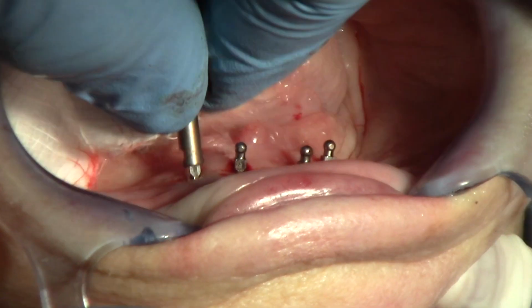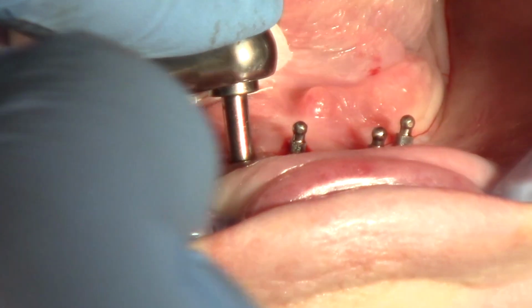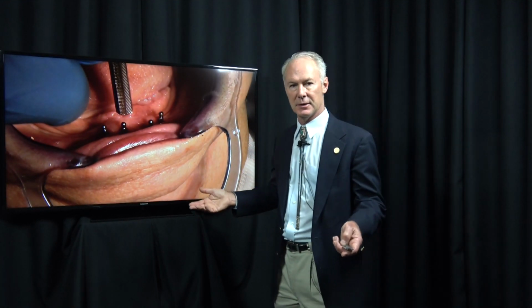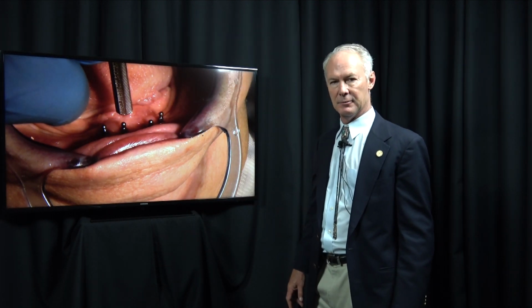So if you can get 4 on the mandible, that's ideal. You can see these are nice and parallel. If you can get 4 implants in the mandible and ideally 6 in the maxilla, that's wonderful. Now, sometimes, especially in the maxilla, you have a hard time finding good bone. And I've had very successful cases where you only had 2 in the maxilla. But ideally, you'd like 6 in the anterior maxilla and 4 in the anterior mandible.